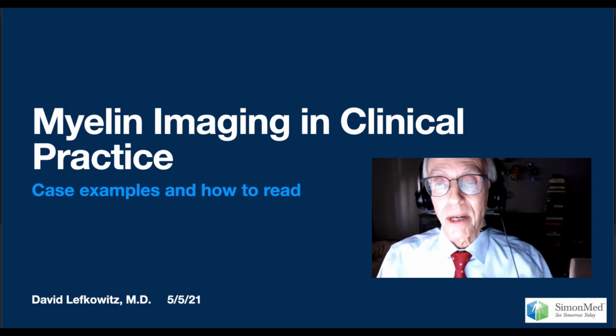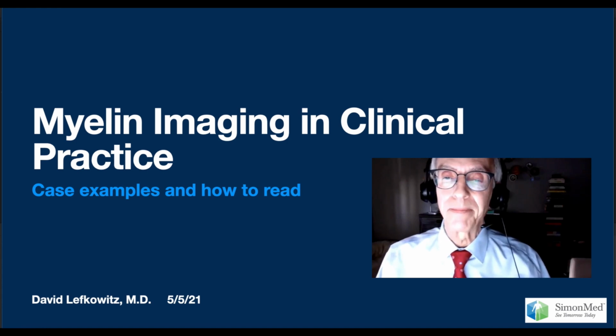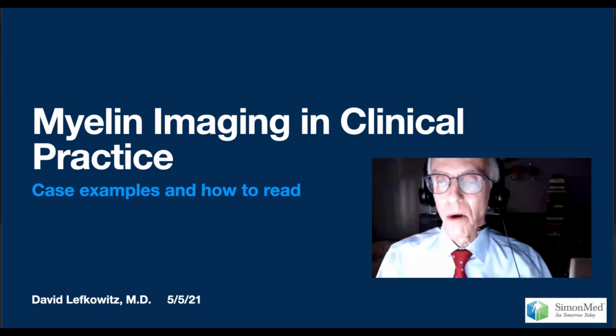There was a time, with the advent of DTI, that diffusion tensors were hoped could serve that purpose, but it hasn't quite worked out. Now with synthetic MR, and more specifically myelin imaging, we have a new tool in our toolbox. We are now finally on the cusp of doing better than non-specific white matter changes.